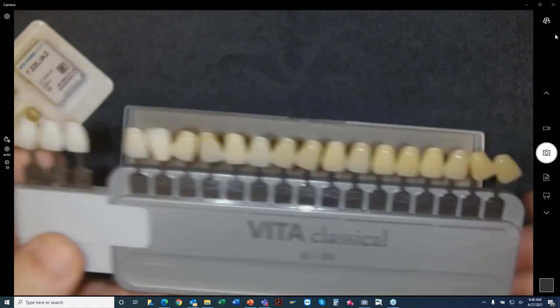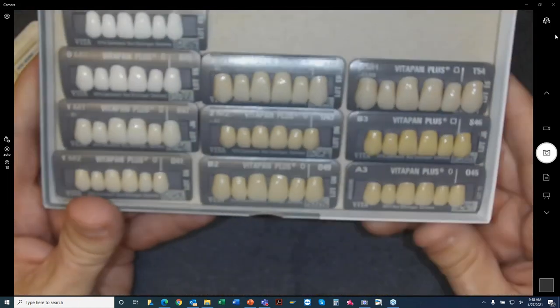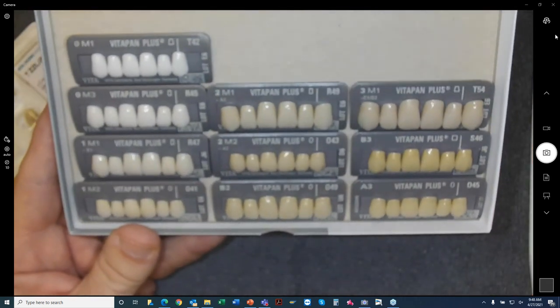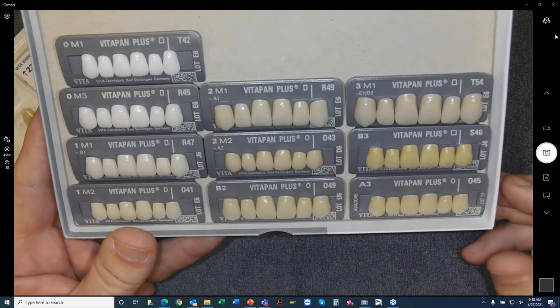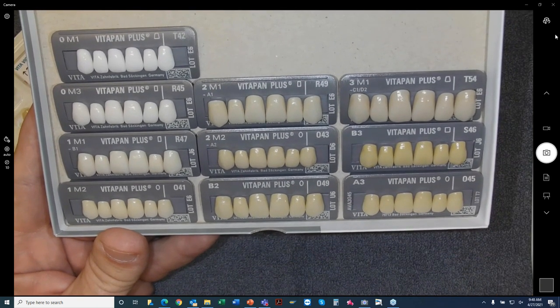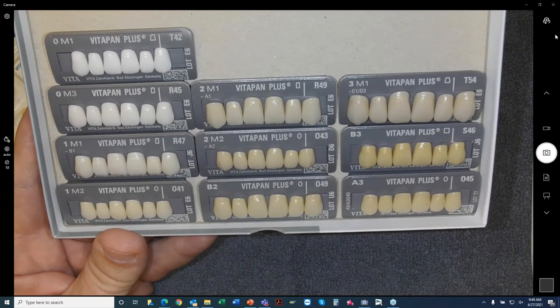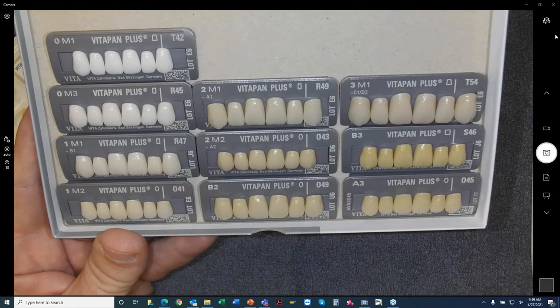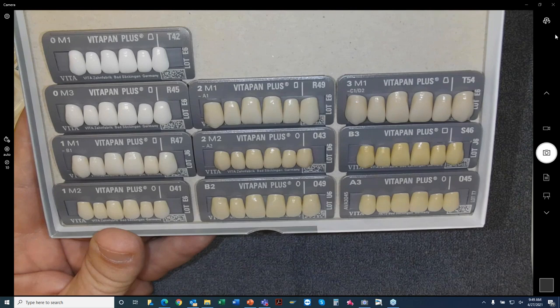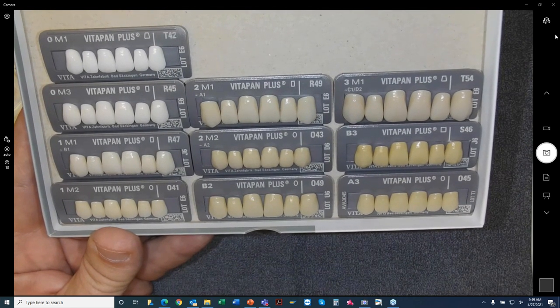I would propose a different method: have your dentist set up a couple of cards of teeth. You can get this to them, right? You can say, hey, doctor, instead of using some oddball shades, especially for a new denture, especially if you're going to start talking to that patient and saying, I want to create you a denture that makes you look a little bit more youthful. I'm not talking about making you 30 years old. I'm talking about making you 50, 60 years old, possibly.